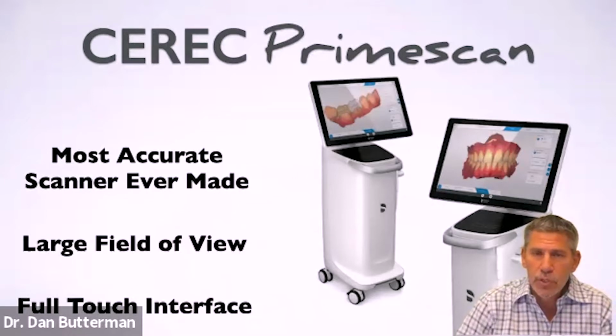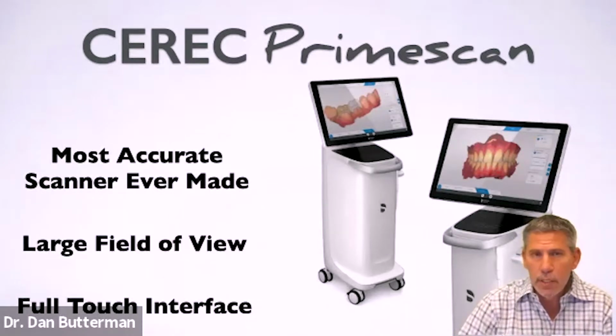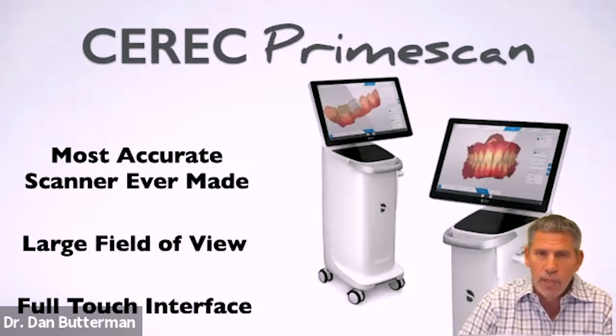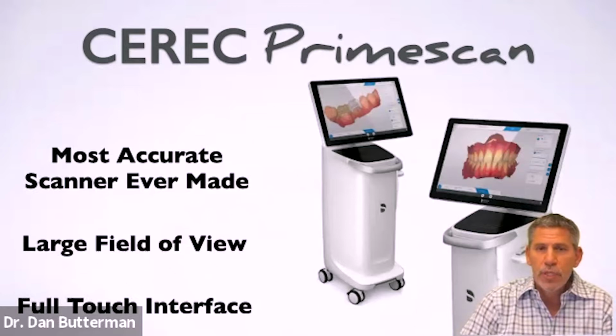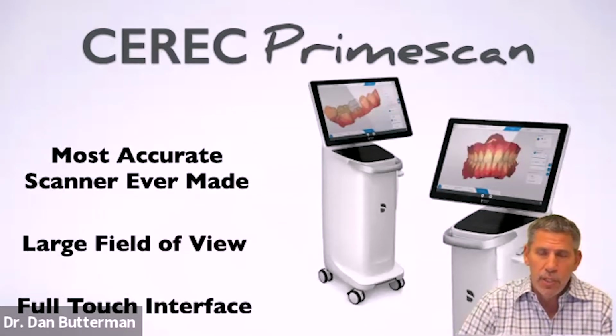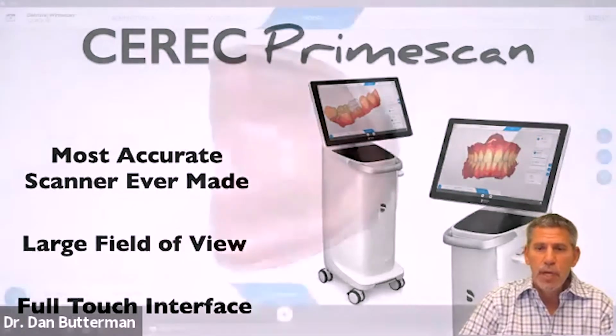There are really 2 versions of this machine that you can look at. One is basically a Connect unit or a digital imaging unit that would allow you to acquire all of the images, and the sole purpose is to send those images elsewhere to a laboratory to design and manufacture. With the change of a license key, you can eventually decide to get into manufacturing, and you can switch this over to a full CEREC machine, meaning that not just imaging is available to you, but actually design and manufacture as well. So keep that versatility in mind as we talk about this.